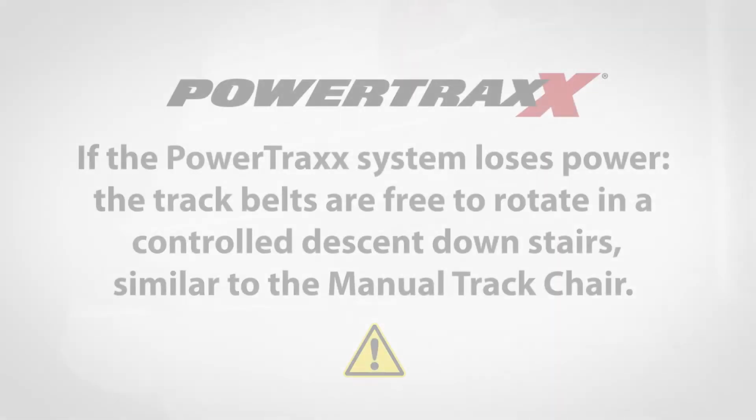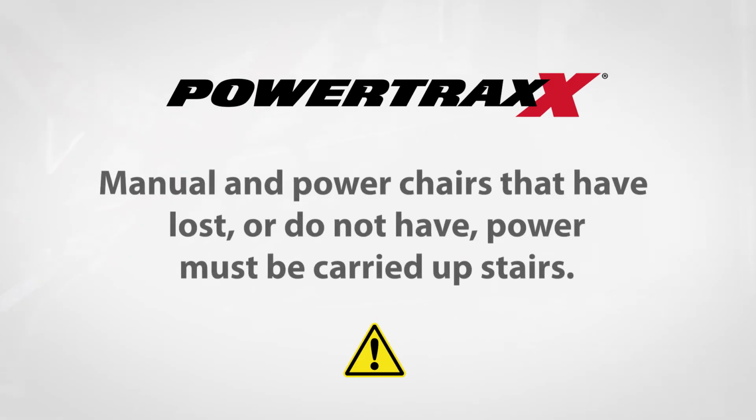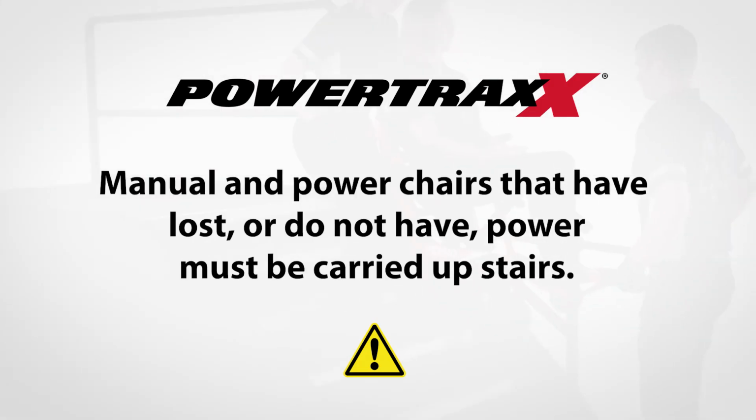If the PowerTraxx system loses power, the track belts are free to rotate in a controlled descent downstairs, similar to the manual track chair. Both manual and power chairs that have lost or do not have power must be carried upstairs.